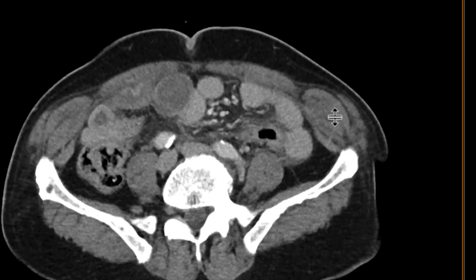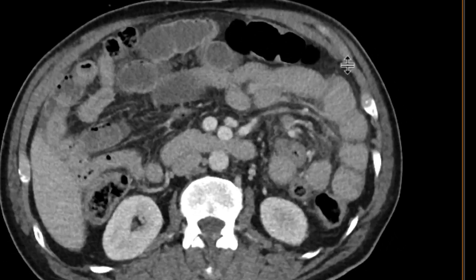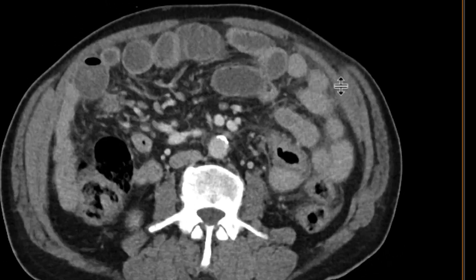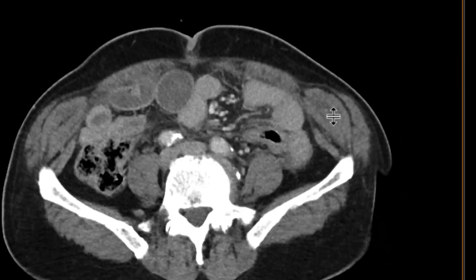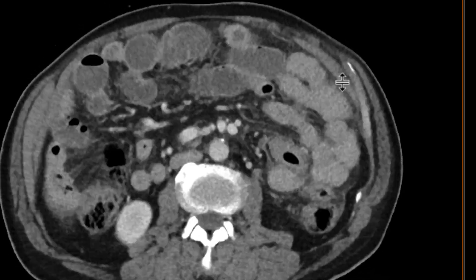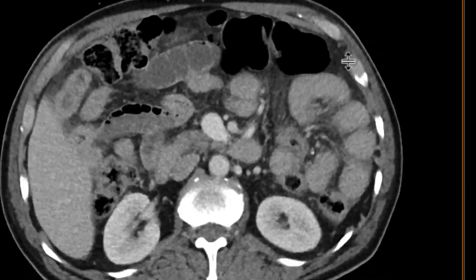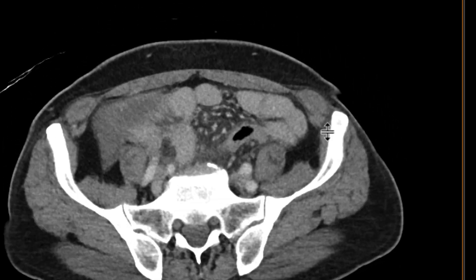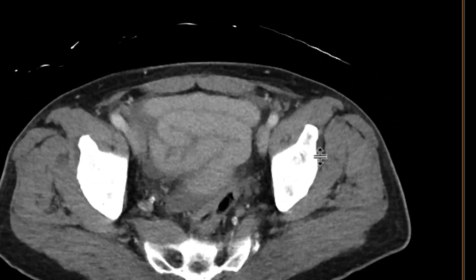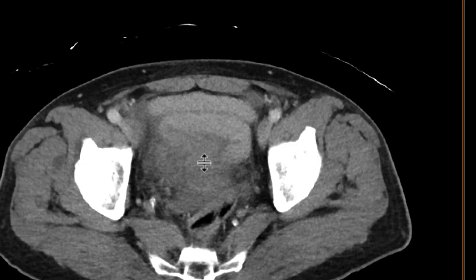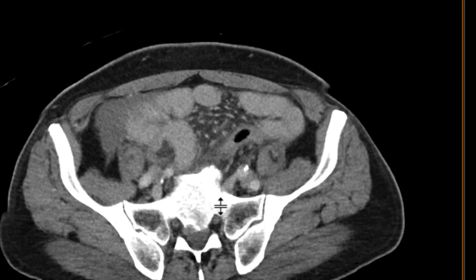As we look at the large bowel, it looks relatively okay — some loops a little bit under-distended, some over-distended, with a little bit of stool in there as well. As you go down, there looks like there's some sort of inflammatory change and fluid right in the pelvis and in the right lower quadrant.